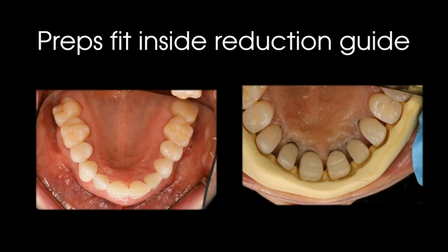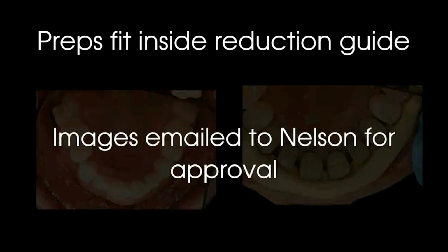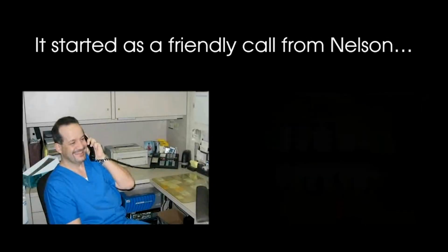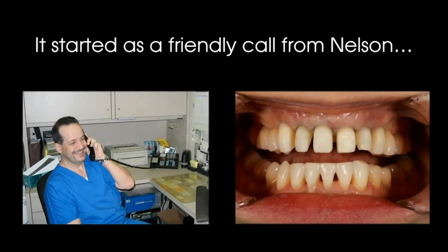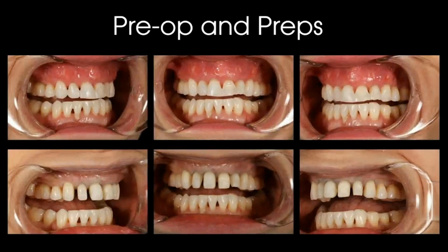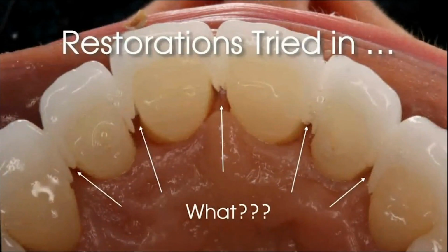They're minimally prepped, but I don't think I tapered it enough, because of the images I sent to Nelson Rigo for approval. It all started as a friendly call, and more or less he says, you've got to reduce it or taper it a bit more. So here are the pre-ops and preps of me doing it the first time, but the restorations tried in, you can see, I can't get that to fit or seal at the cervical.